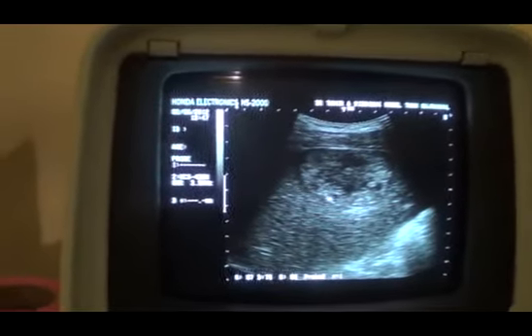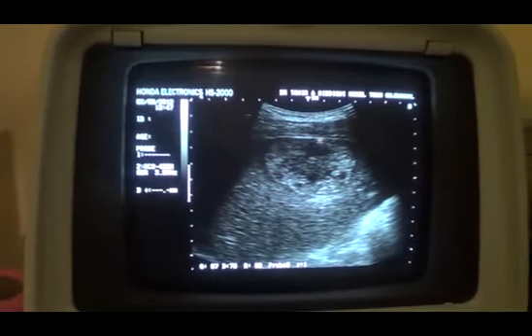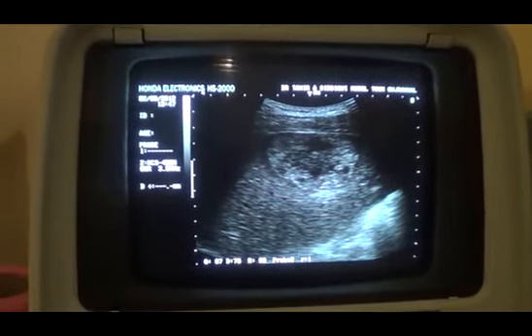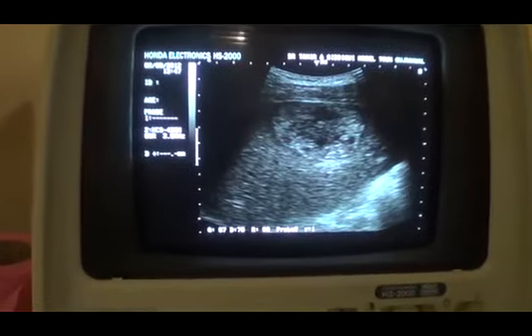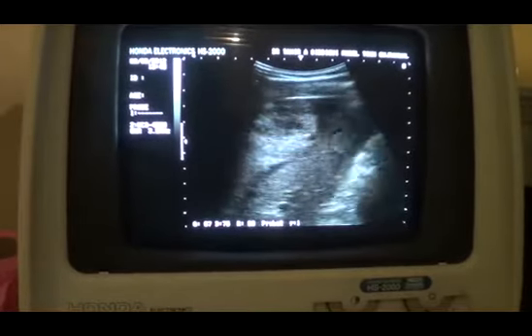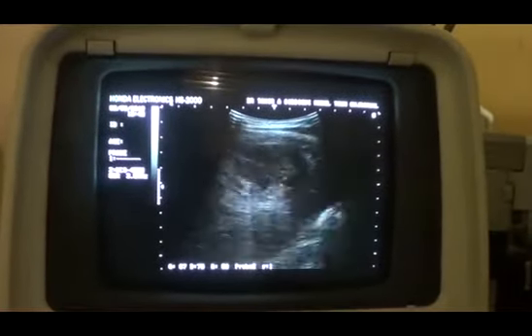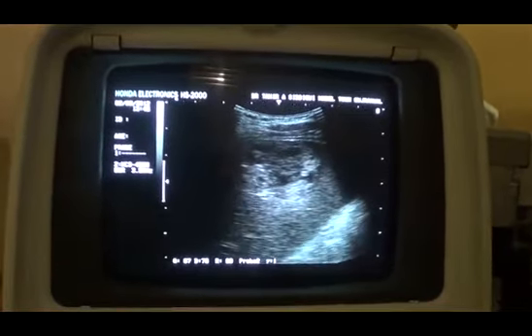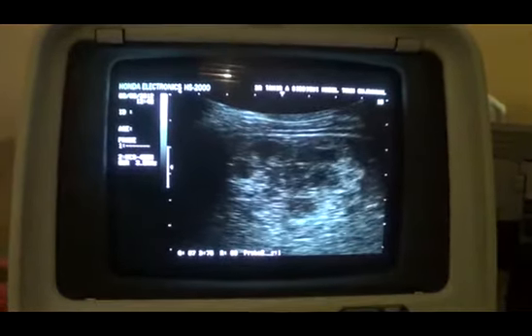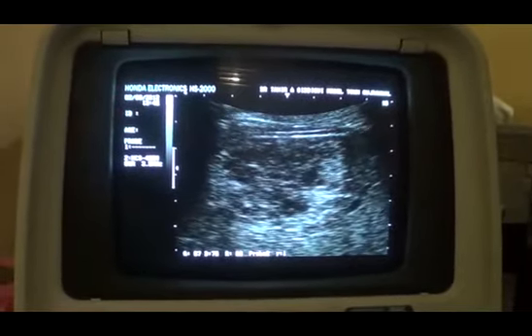These are variable sized cystic areas within this solid echogenic mass with no posterior acoustic enhancement or shadowing, and it does not change its shape while the probe is moved. So in an otherwise normal liver with decreased parenchymal echogenicity, we are seeing a focal lesion with multiple internal tiny cystic areas of variable size and shape.